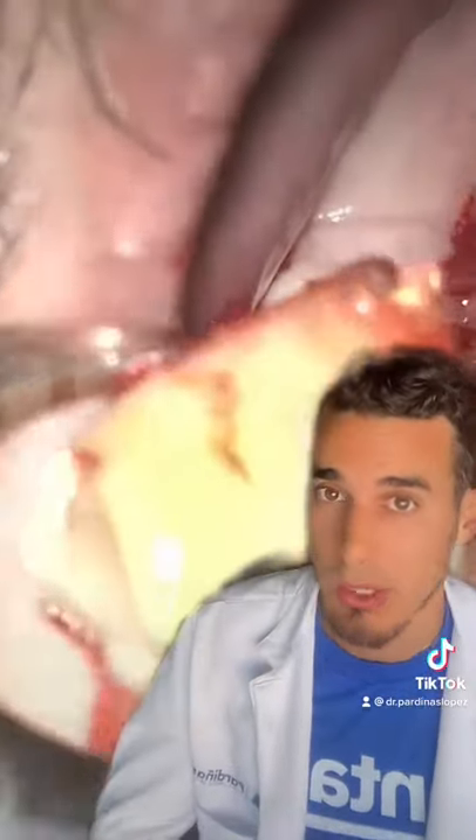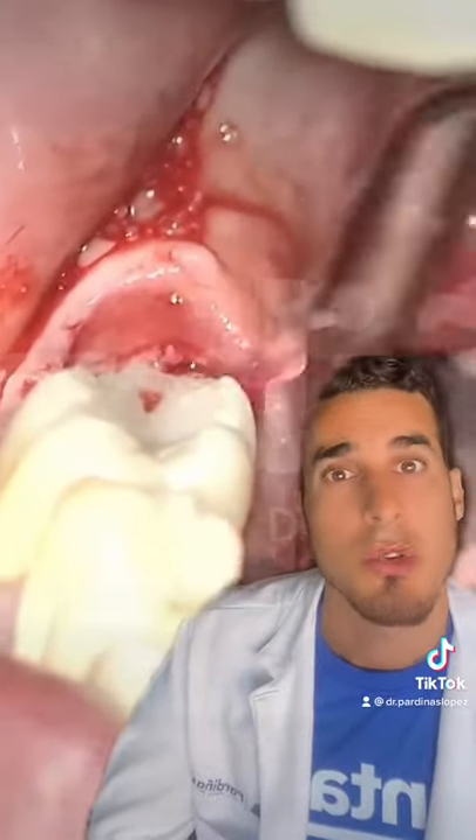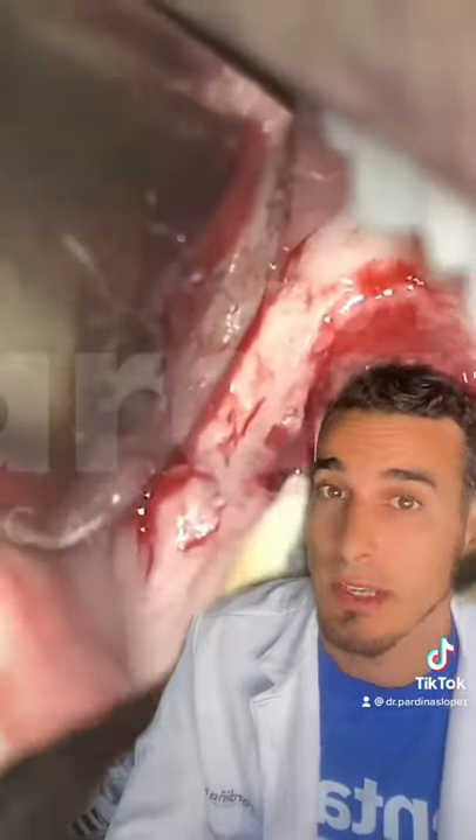After the tooth is extracted we're gonna scrape the socket with an instrument called curette to remove any possible infection. And to finish, the area is cleaned using saline solution.